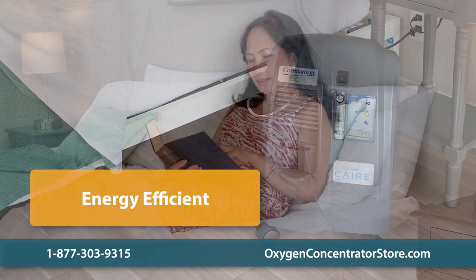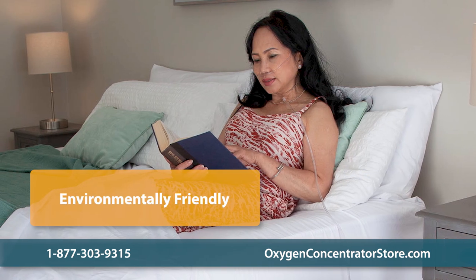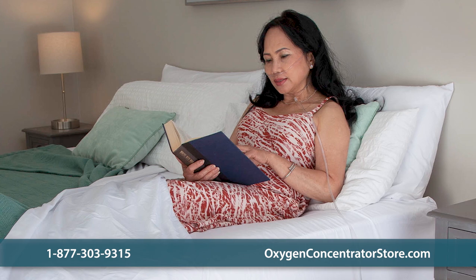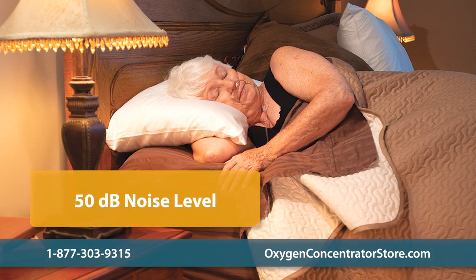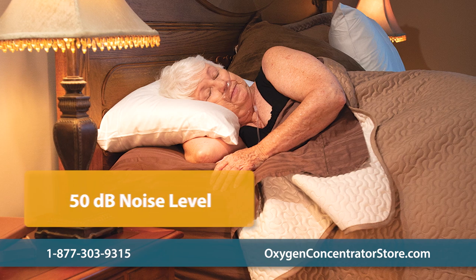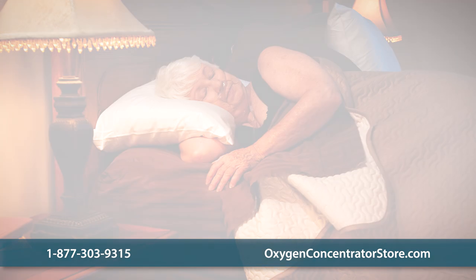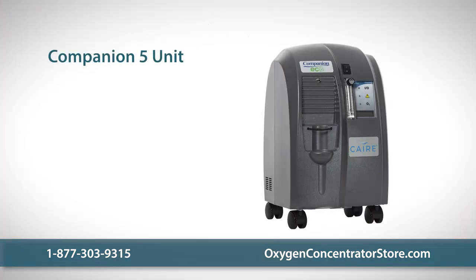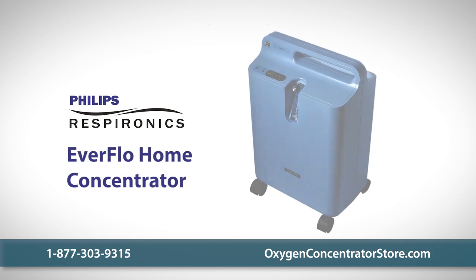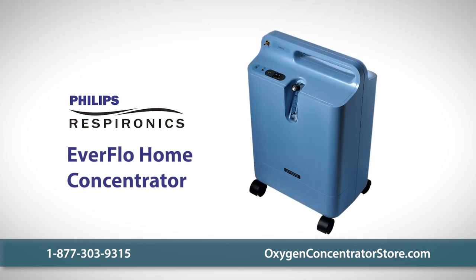At its highest settings, the Companion 5 uses 350 watts of electricity, making it one of the most energy-efficient and environmentally friendly stationary oxygen concentrators. With a noise level of only 50 decibels, the unit is no louder than a quiet conversation, making it ideal for use during sleep. The Companion 5 package includes the unit, a cannula, and a user manual.